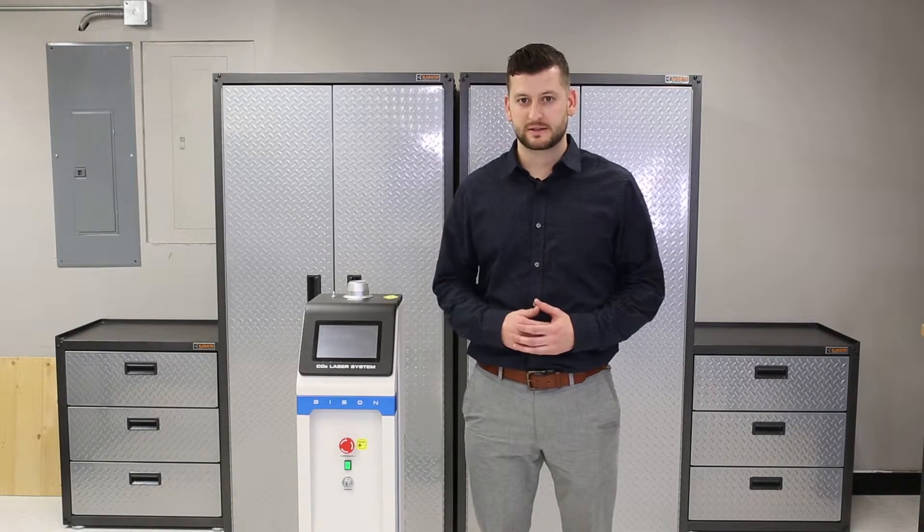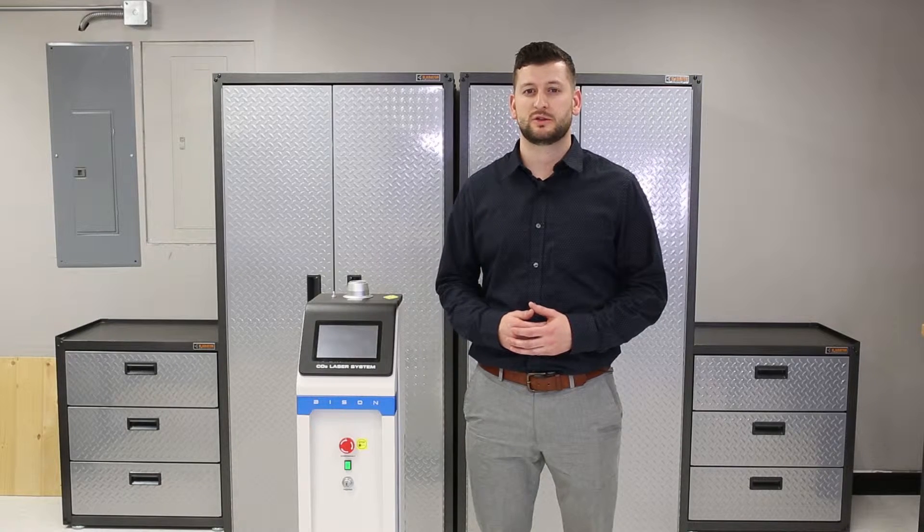Hi, I'm Austin with Whitecap Institute. Thank you for purchasing the Bison Laser. Today I just wanted to show you a quick tutorial of how to set it up.